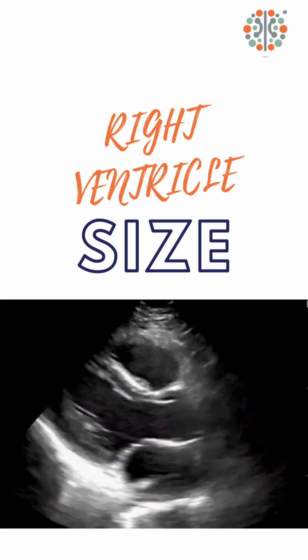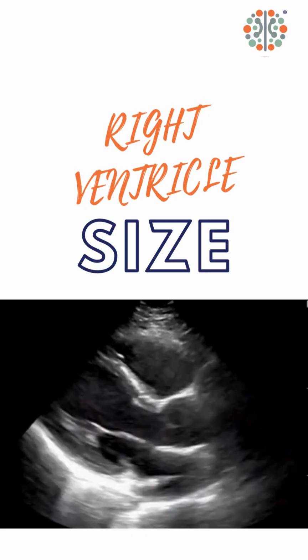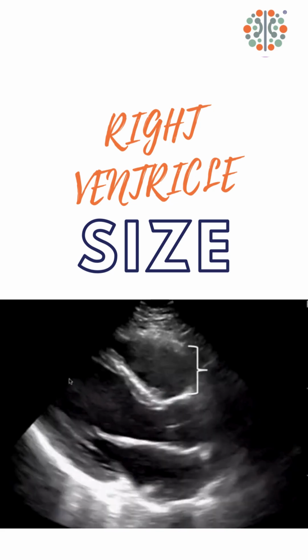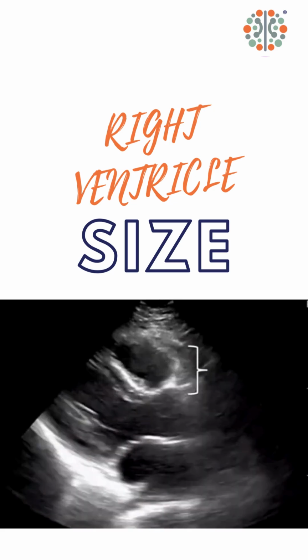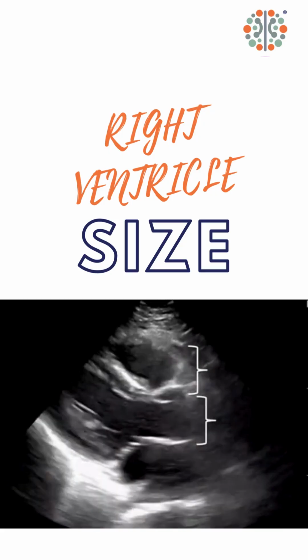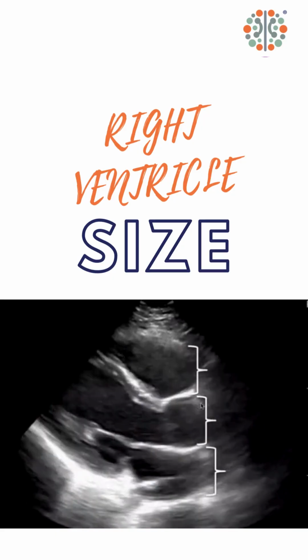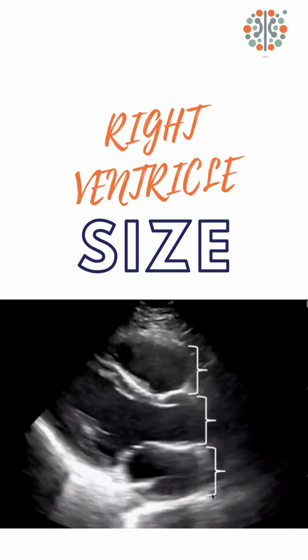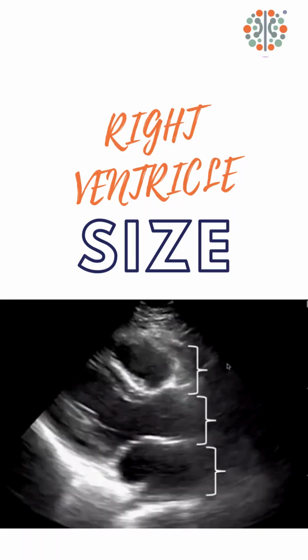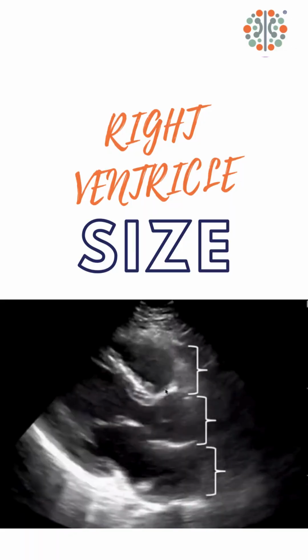Lastly, for our pathology in this video, we will briefly discuss right ventricular function. As you see here, we break the video into thirds. In a normal view of the right ventricle, it should take up about 1/3 of the parasternal long axis view. In right ventricular dysfunction, you can see the right ventricle, which as you now know is most anterior and closest to your probe in this view, can take up to 50 or 75% of the view. This would require more investigation into that pathologic finding.